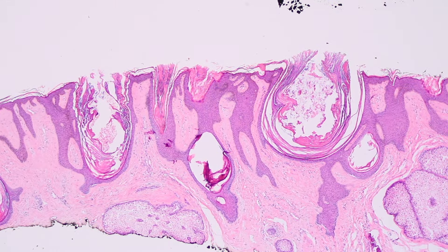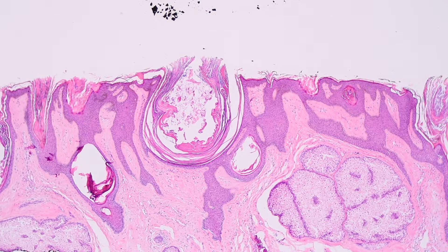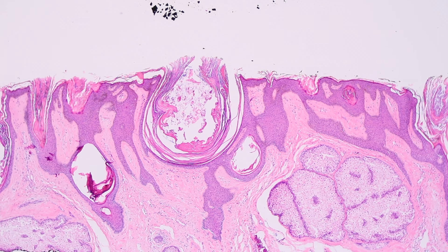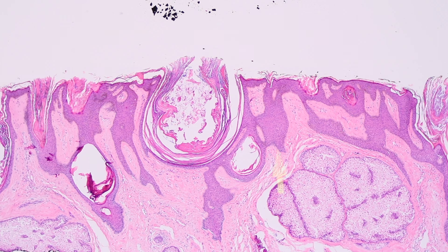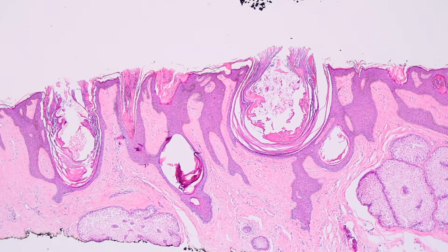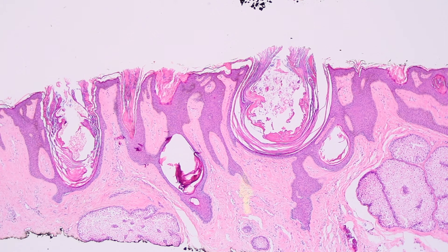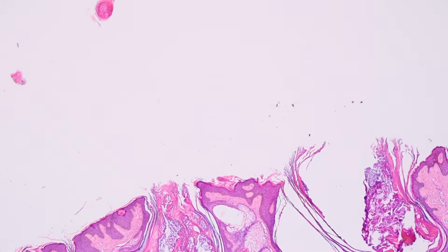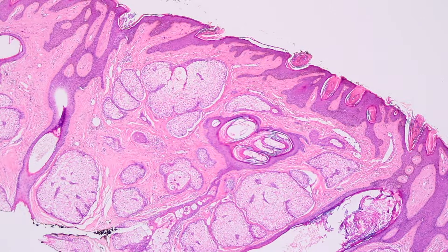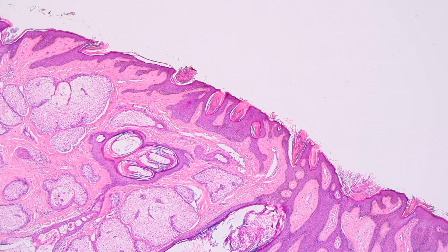Here's a different case. You can see the epidermal hyperplasia again, although the surface of the skin is actually pretty flat — not really papillomatous or verrucous. You have long rete ridges pushing down and anastomosing with one another in a complex pattern. Most notably there are dilated comedonal spaces and little cysts filled with keratin. This could give you the impression, at first glance, of a seborrheic keratosis, and I've seen cases that looked even more like one.